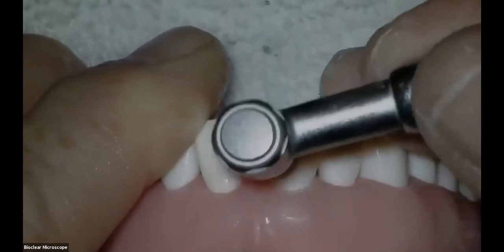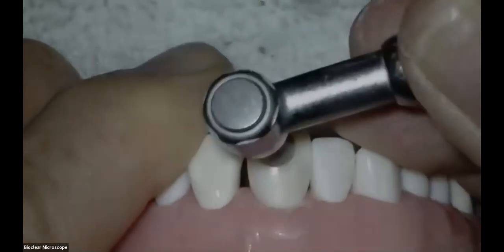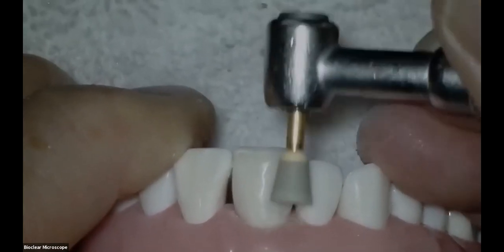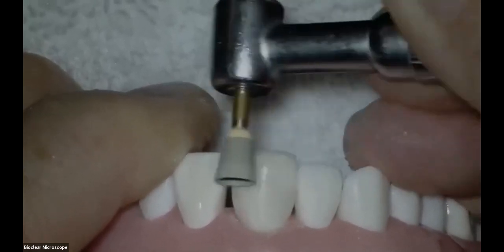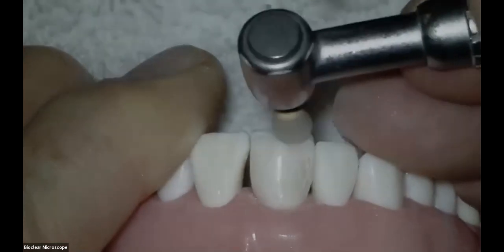Okay, go ahead. And then I can go ahead and use the cup on its side to create a little bit of mamelon groove development. And now wet.